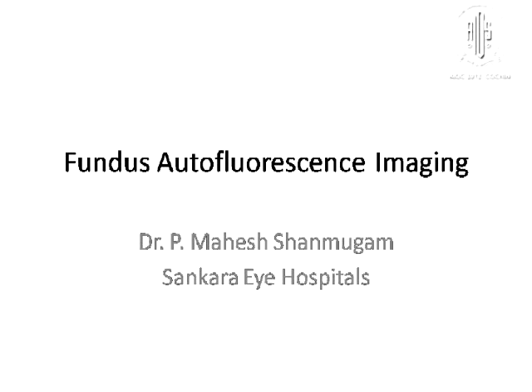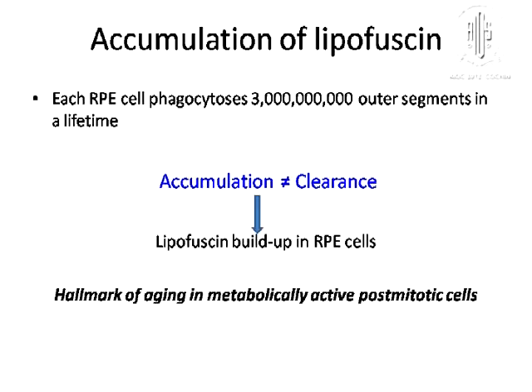So we'll be talking about autofluorescence imaging, which is a complement to existing imaging modalities like fundus fluorescein angiogram, color photograph and ICG angiography, and should not be seen by itself. So what is the basis of this autofluorescence imaging? Essentially, autofluorescence images the lipofuscin.